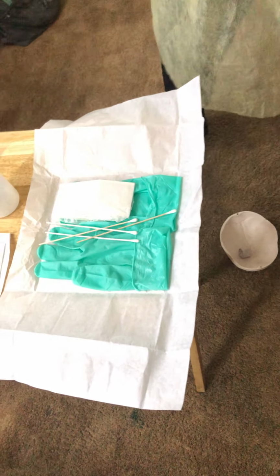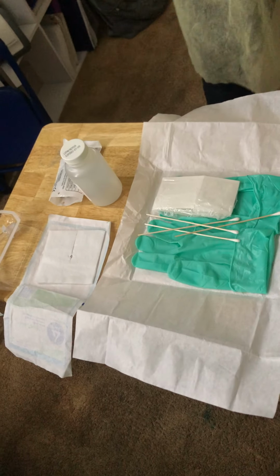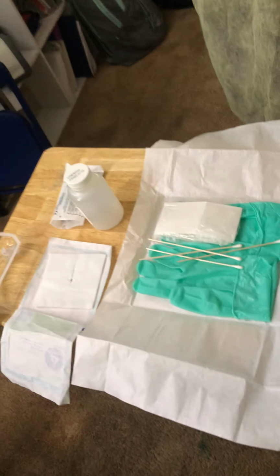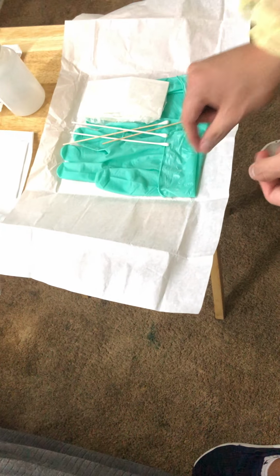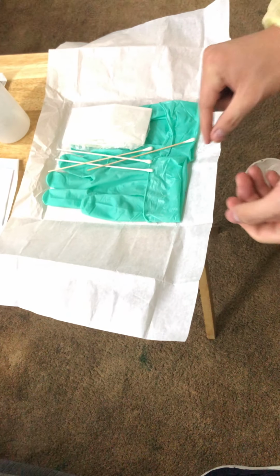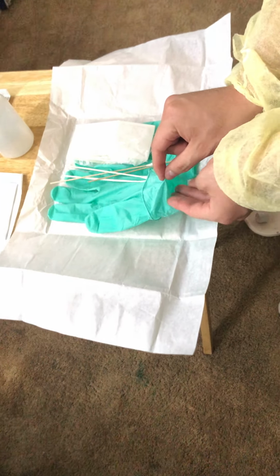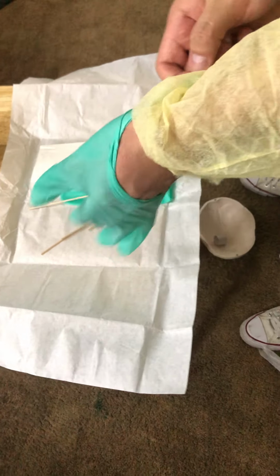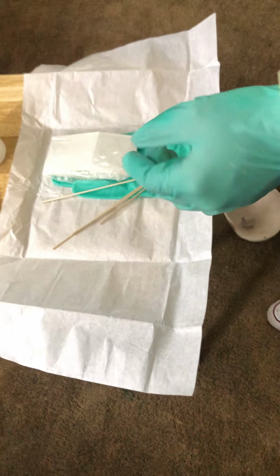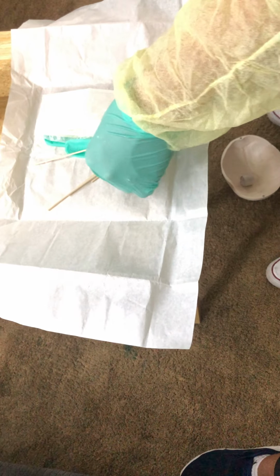Okay, so at this time, I'm going to go ahead and hyperoxygenate my patient, putting in the oxygen, 100%, 1 minute. I'm going to go ahead and perform sterile gloving. Before I do that, I'm going to do hand hygiene, then perform my sterile glove. There we go. Fix my swabs.